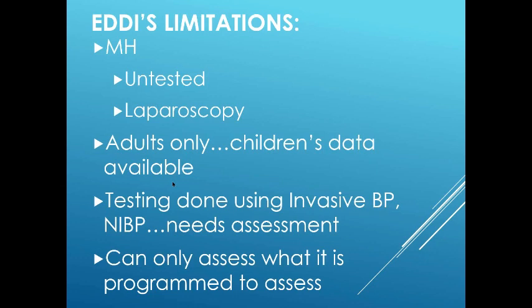The program was constructed primarily for major surgery and the use of invasive arterial pressure monitoring. We do have NIBP incorporated into the system, but it is less fully tested. It can only assess what is programmed to assess, and we have covered the possible diagnostic suggestions.